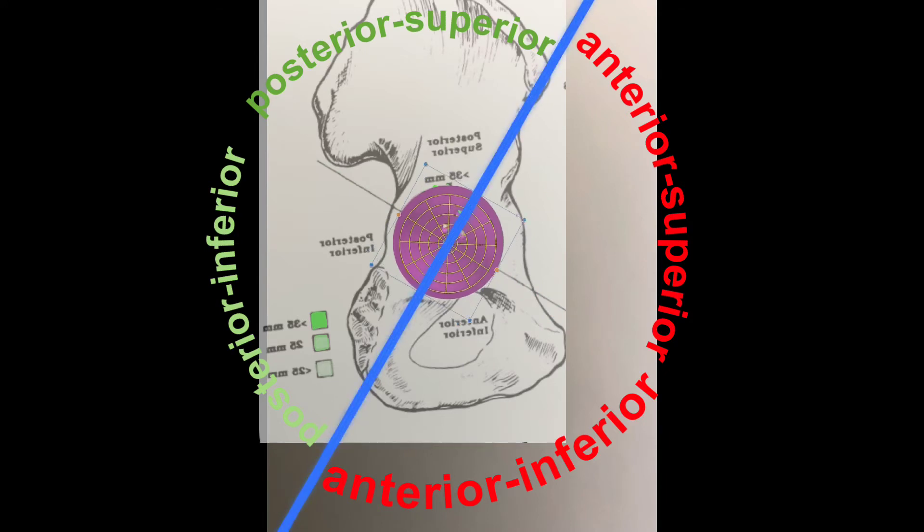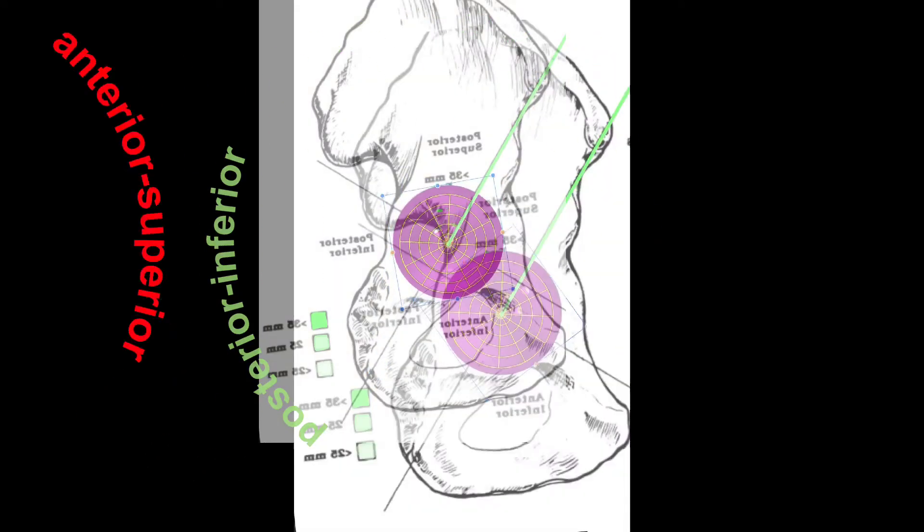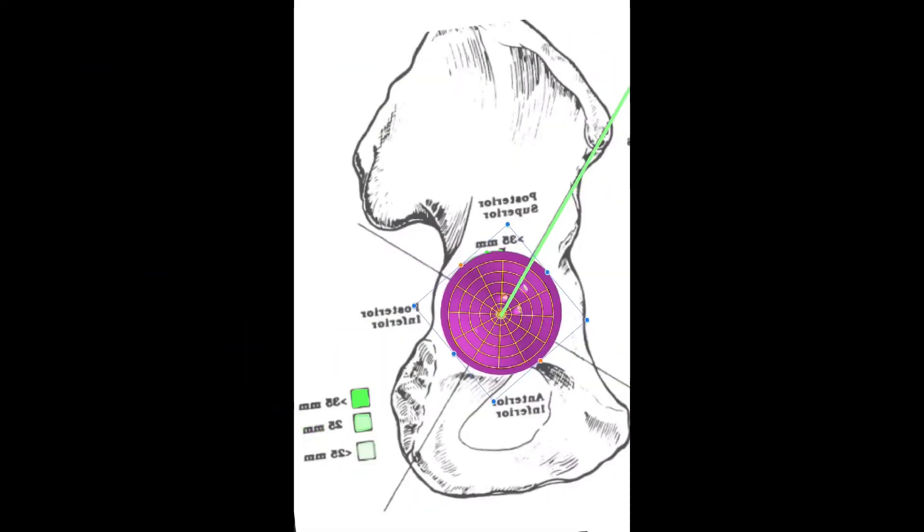Green area presented over the cup surface in augmented reality shows the best area for screw placement. The surgeon can adjust the rotation of the cup so that the cup holes are in optimal position for safe screw placement.